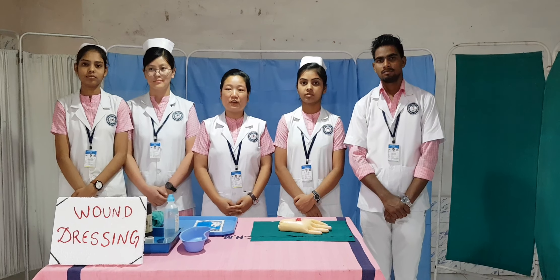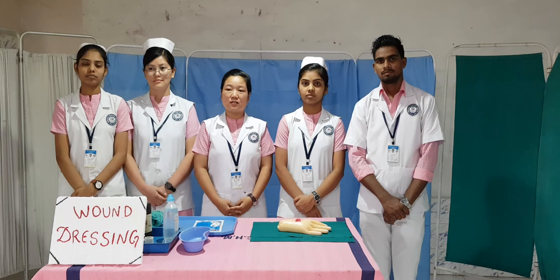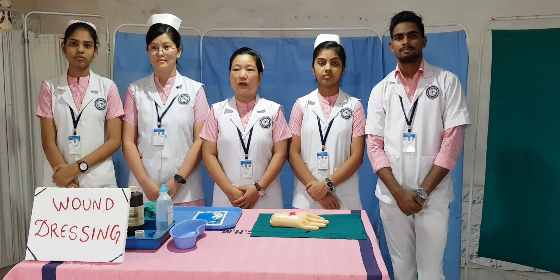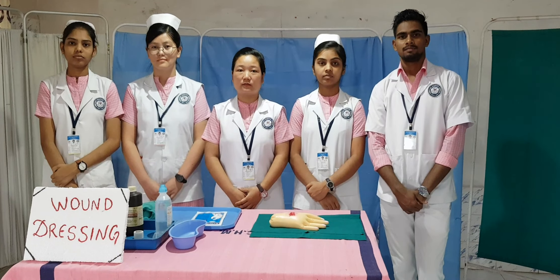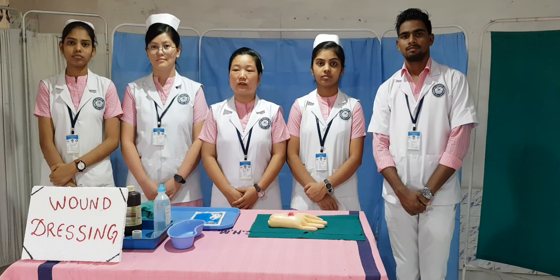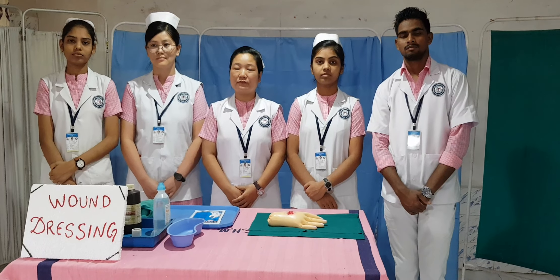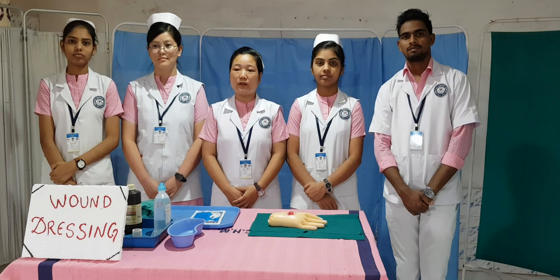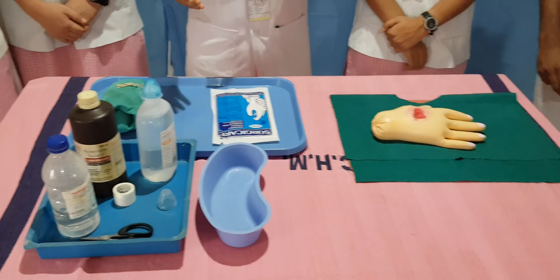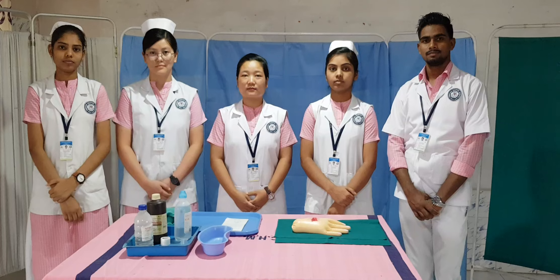Because without self-confidence and knowledge, if we do a direct procedure on the patient, it can cause complications. For wound dressing purposes: number one, protect the wound from infection and microorganisms; second, protect the wound from swelling with body fluids and waste; number three, immobilize the injured part. These are our wound dressing articles and this is our simulation model.